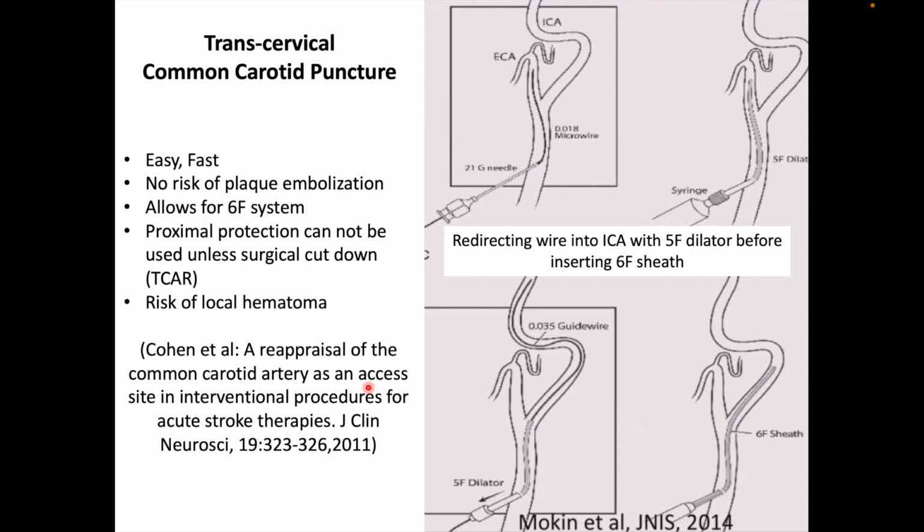The other thing is that if a carotid hematoma develops and compresses on the airways, then it might become difficult to intubate that patient later on. So the best is to intubate him first. The neck will now be static, he won't be moving his head, and the airway is protected. And now you go in and do the carotid puncture.